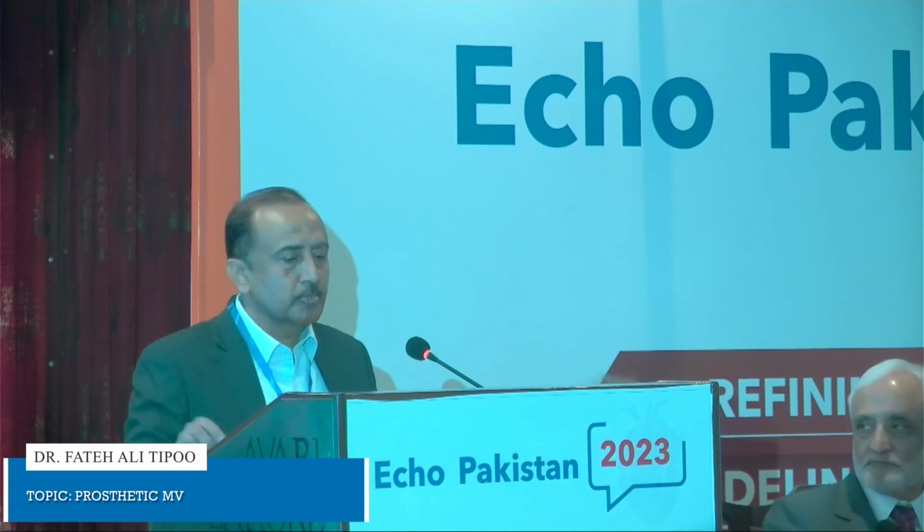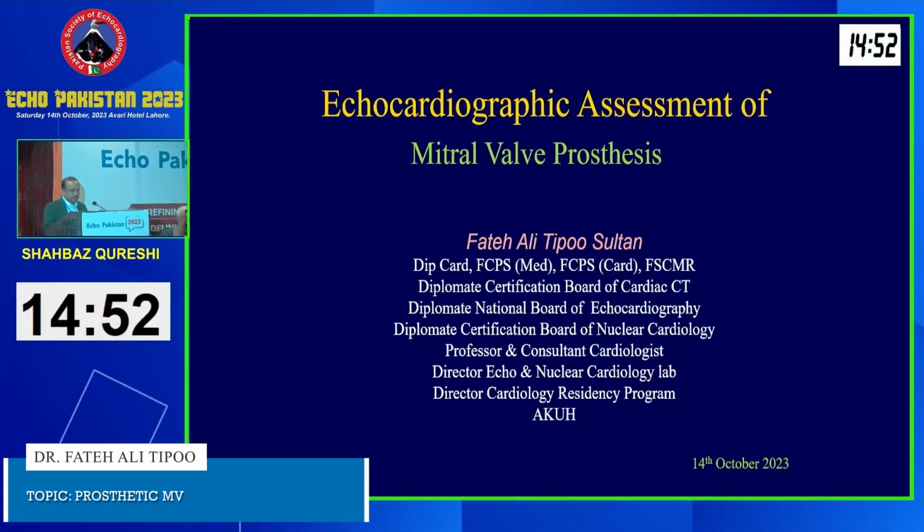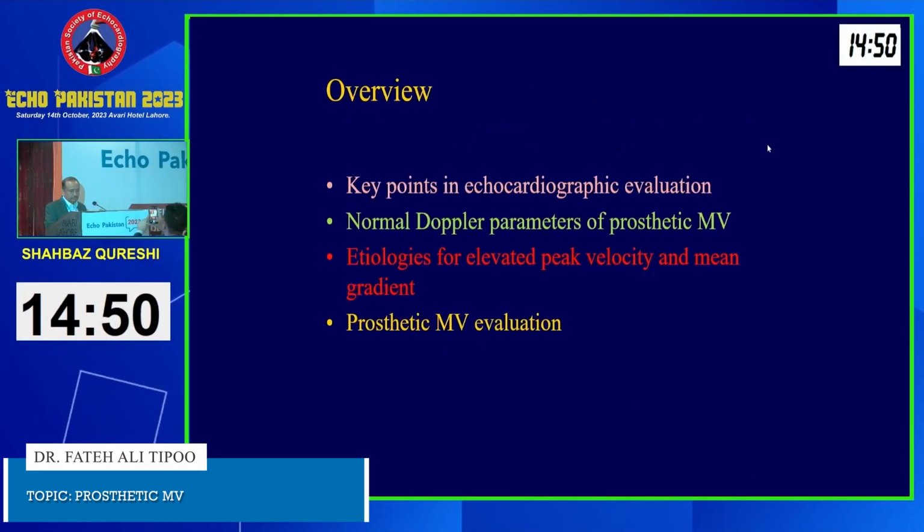The topic of my talk is echocardiographic assessment of mitral valve prosthesis. So this is a brief overview of my talk.